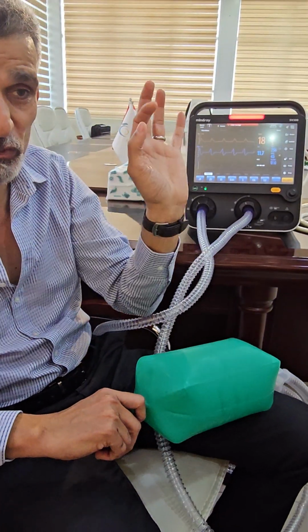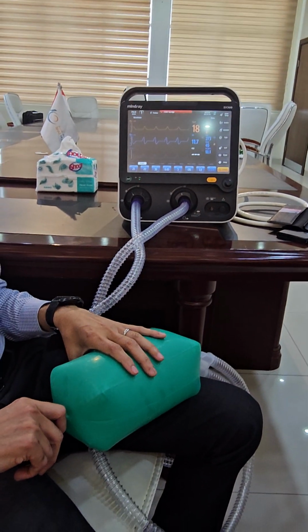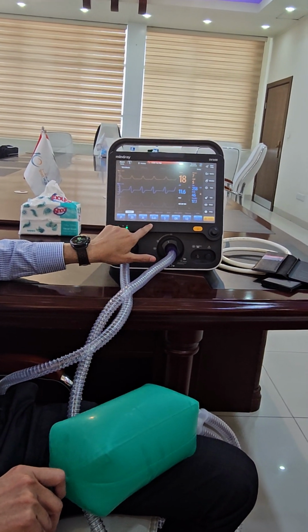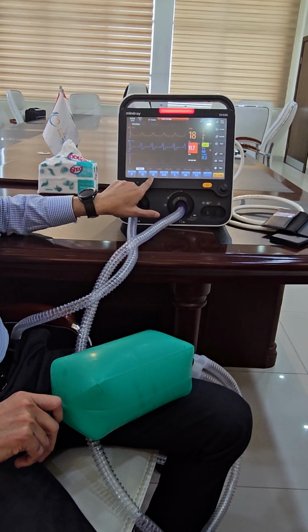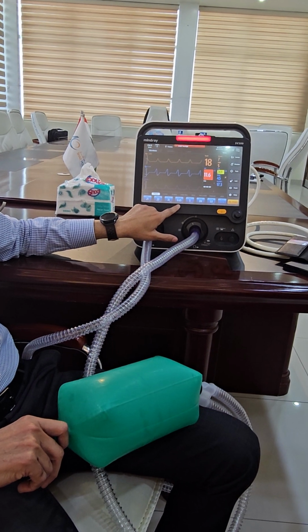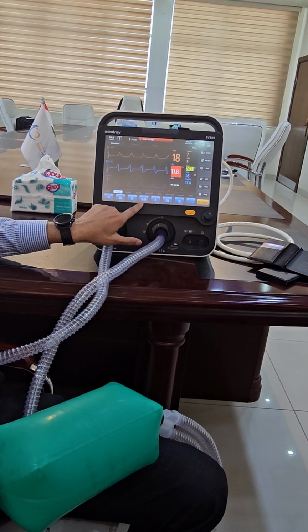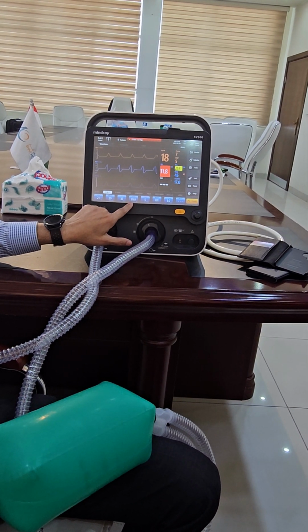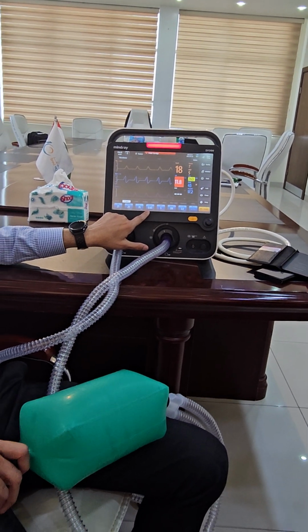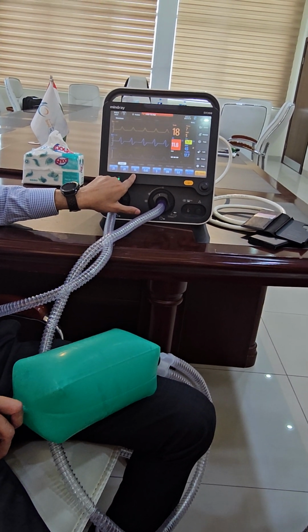Very important in neonatology: always hit equal after each calculation. Let's go back, it's a very important trick. How many times are we breathing? 35. Each time, how much? 0.65. So 35 times 0.65, hit equal after you do it, is 22.75. So this is the total amount of inhalation time, and the remaining time is for exhalation and pauses.